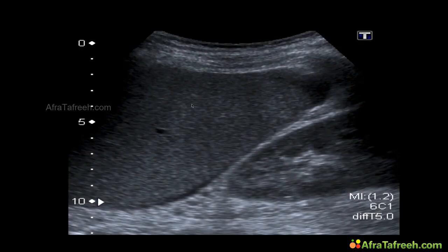Now let's take a look first at a picture of an adrenal gland, what this organ can look like when detected. In this picture, we see the spleen over here and the left kidney, the upper pole of the left kidney. And when you really look closely, you can detect an area here. It's pyramidal shaped. And when you know what to look for, you can see this region over here is the left adrenal gland. So this is what an adrenal gland looks like when it is detected.